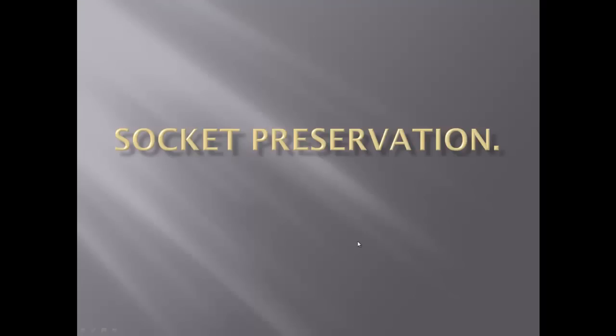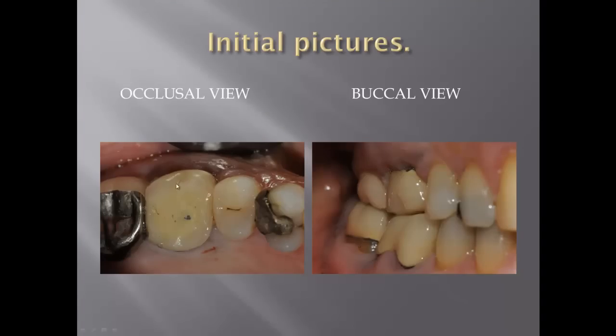So this patient presented, it's number 3. From an occlusal view and the buccal view, there is perio probing in the bifurcation area. The patient has some symptoms on biting, on and off, but not present today.